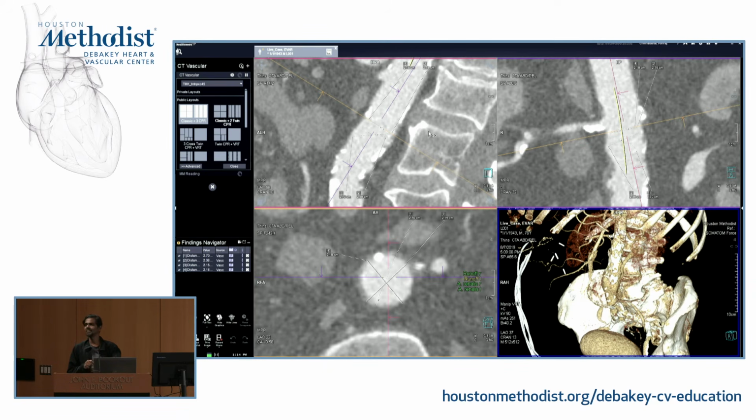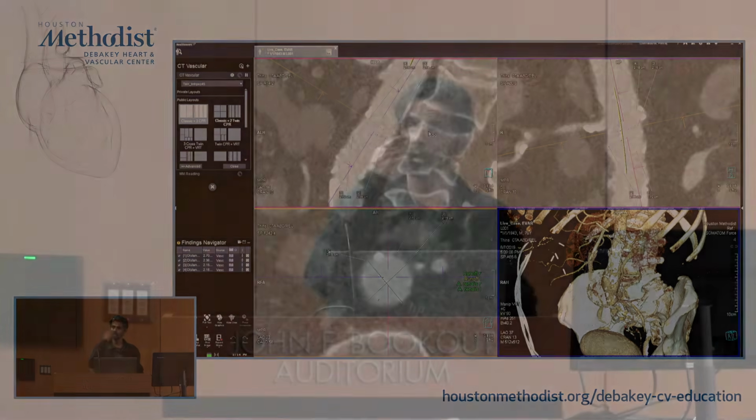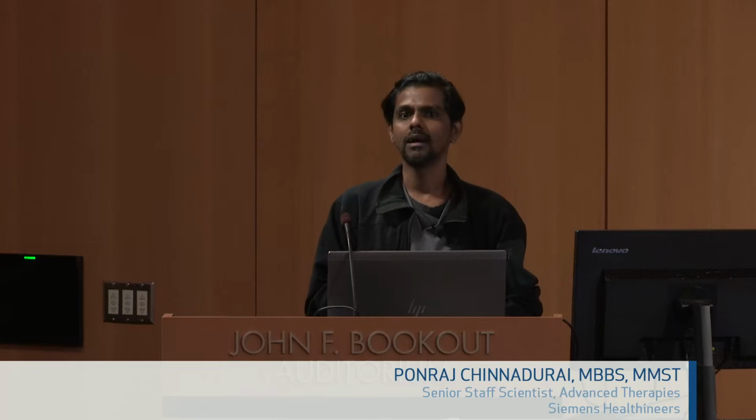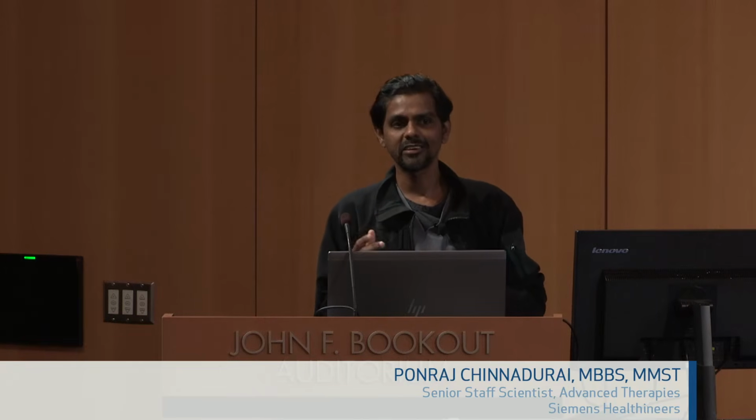You can do it in Windows, but the software is not as good as Horos, I would say. But I am pretty sure your hospital has access to these multiplanar views. More PACS systems now have 3D multiplanar reconstruction capabilities, and now there are even web-based DICOM viewers coming up. So in a few years, I see this being available in most PACS systems, and there is no reason or justification not to learn this.